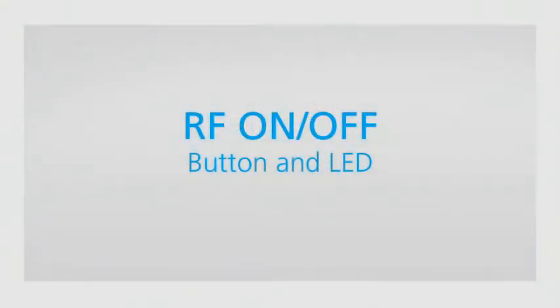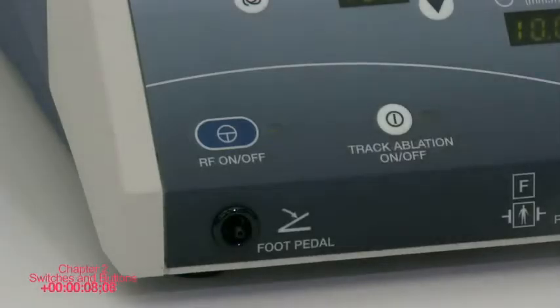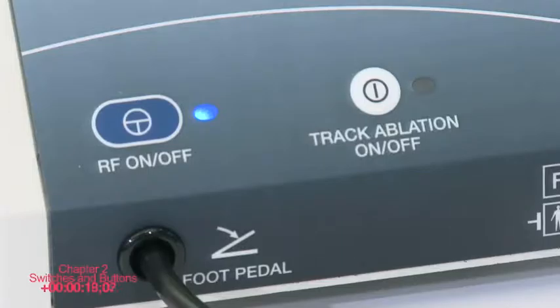RF on-off button. Pressing this button turns the RF energy on and off. RF on-off LED. A blue light-emitting diode that flashes once a second when the system is in ready mode. When RF energy is turned on, this LED stays on continuously.